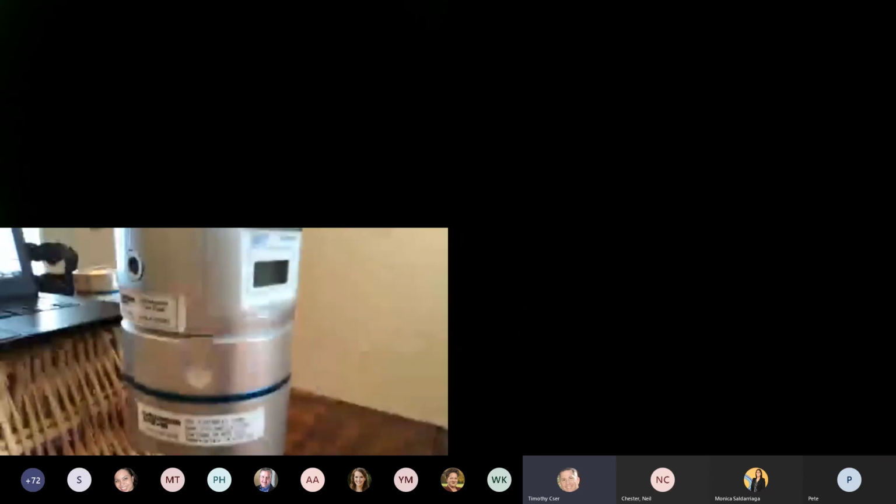Maybe if I get a little light. There, is that better? So that's reading 97.3. I'm going to go down a little bit more. Is that a little better? No, it's the same. Still too dark. Okay, let me do a little more light. How about that? No.